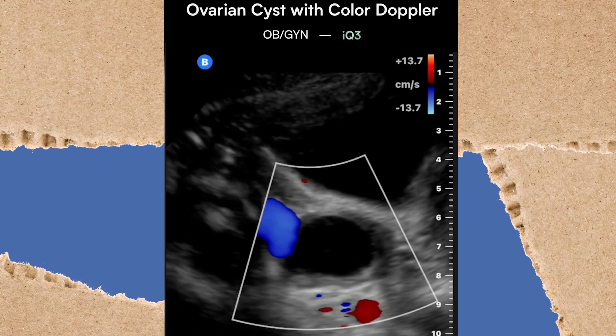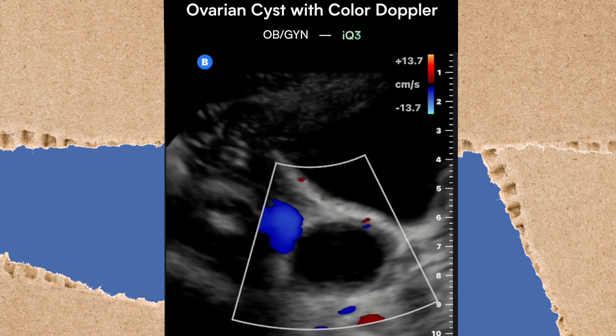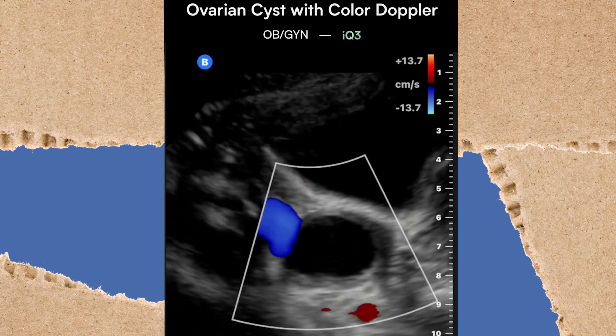In looking at these images, we're going to take a look at the color on this IQ3. Look at that crisp color — it really tightens up the frame so you can truly see the color in the most accurate way.